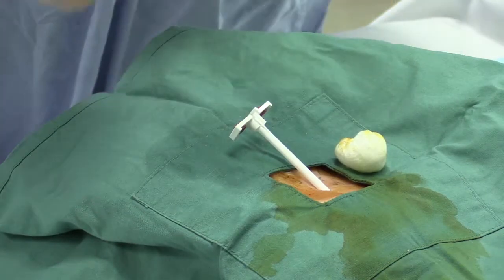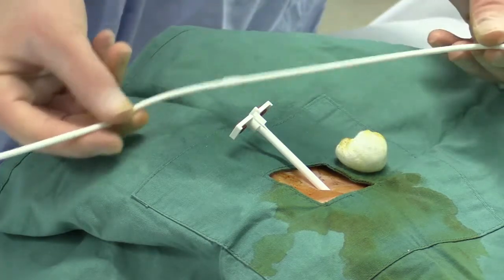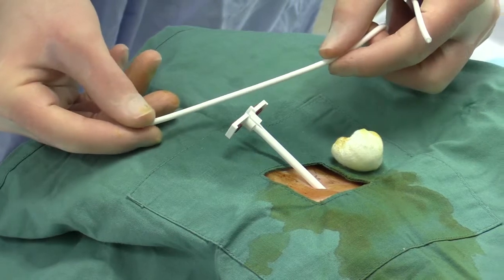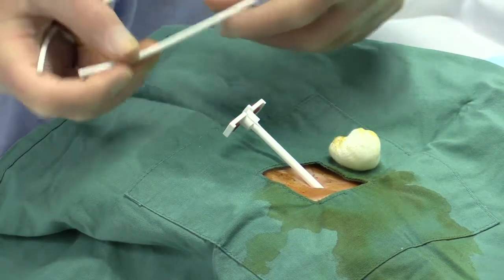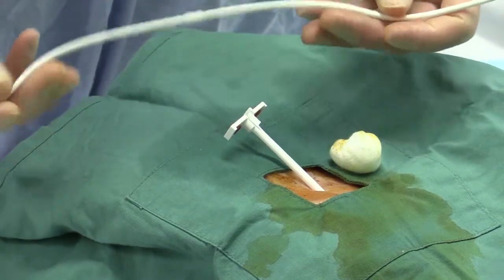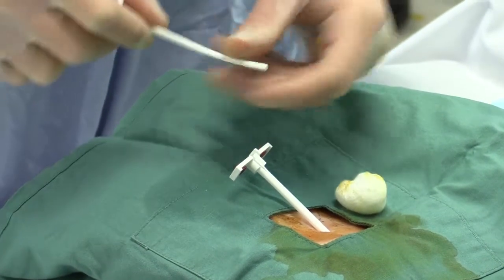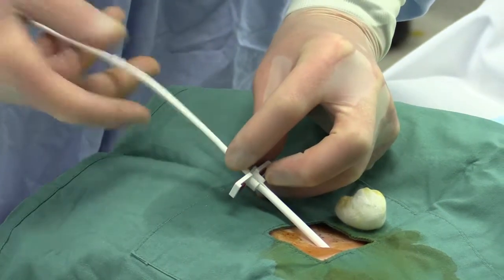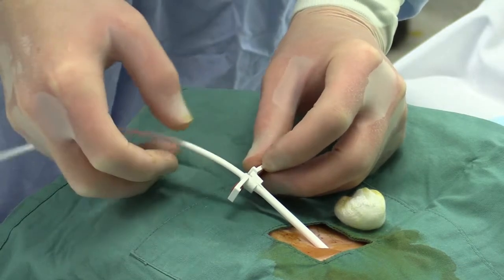The Tenckhoff catheter obviously has two ends and a single cuff. The end with the small holes in it is the end that goes into the peritoneal cavity, as opposed to the end which has no holes in it and traditionally is further from the tip to the cuff. Gentle insertion of the Tenckhoff should go easily into the hub.